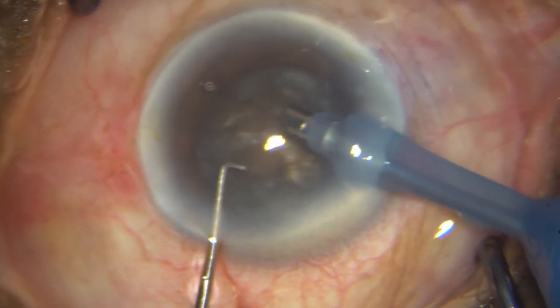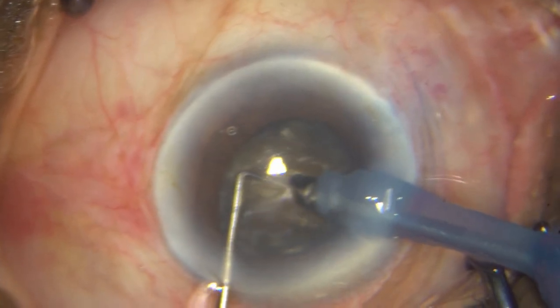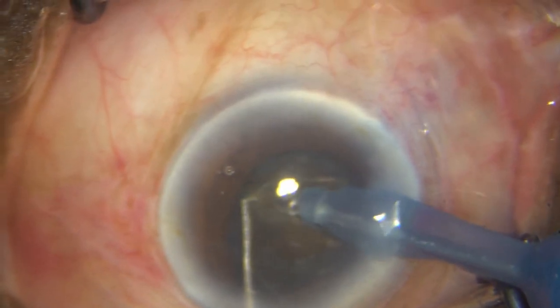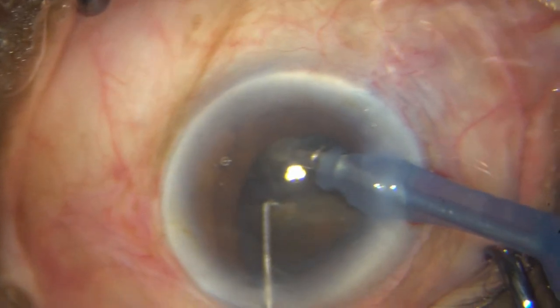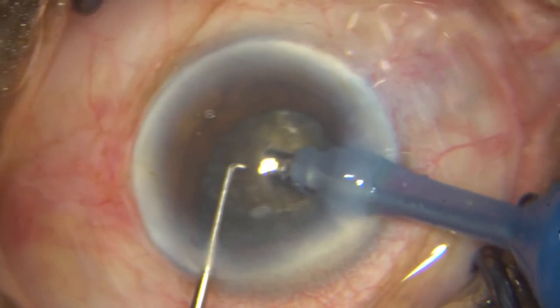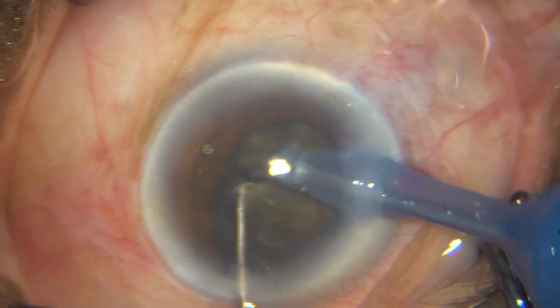I am going to do a direct chop. You can already see almost a reverse pupillary block happening, but I have to start doing the chops — there are no half measures here. I haven't impaled completely, but impaled enough, and I am tearing it. You can see it's like a leathery cataract. This is a diabetic patient, obviously — these are the people who have these hard leathery cataracts. I have already planned that I need to make a minimum of 6 fragments, if not 8, and keep breaking while trying to see the posterior capsule as you separate the pieces.